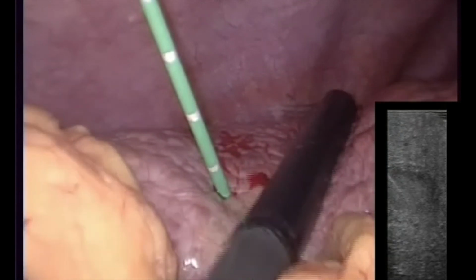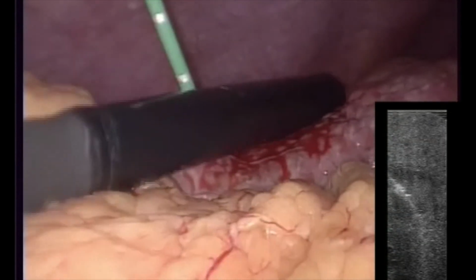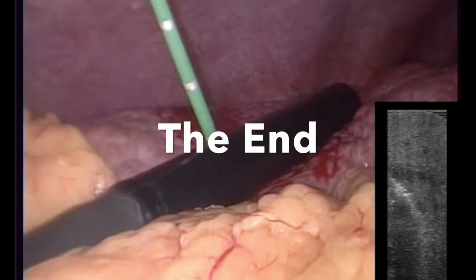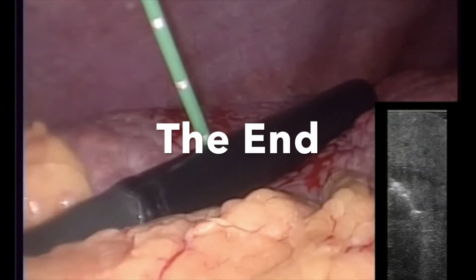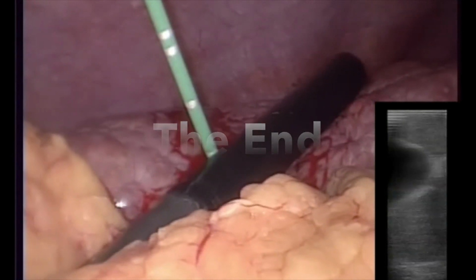In the treatment of hepatocellular carcinoma, laparoscopic thermoablation proved to be a safe and effective technique, as it permits to successfully treat neoplastic nodules in inconvenient locations, not manageable by percutaneous approach, with a low morbidity rate.